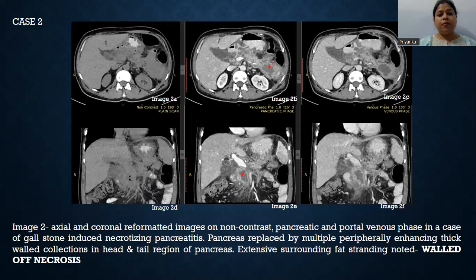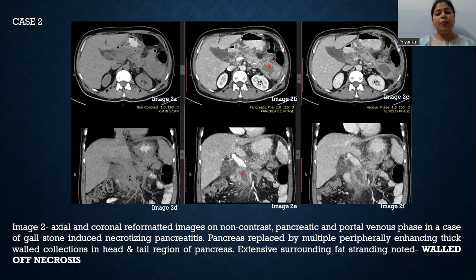In the second case, axial and coronal reformatted images on non-contrast, pancreatic, and portal venous phases are shown in a case of gallstone-induced necrotizing pancreatitis. The pancreas is replaced by multiple peripherally enhancing thick-walled collections in the head and tail region. There is extensive surrounding fat stranding. Findings are suggestive of walled-off necrosis.